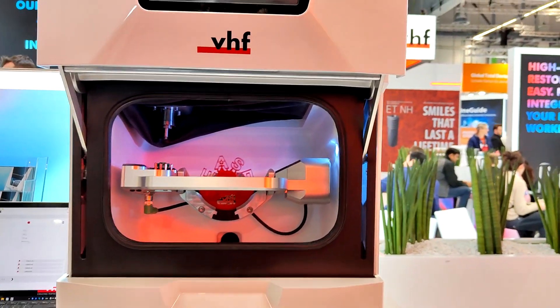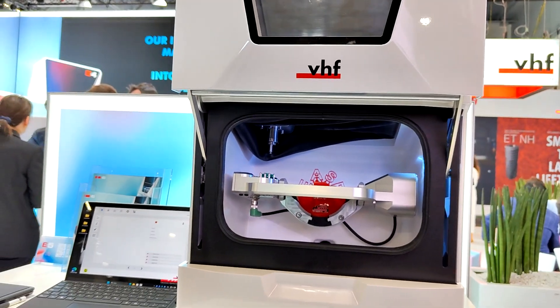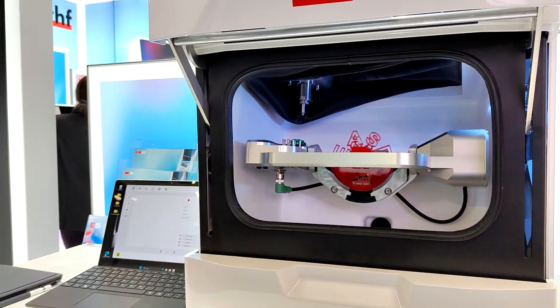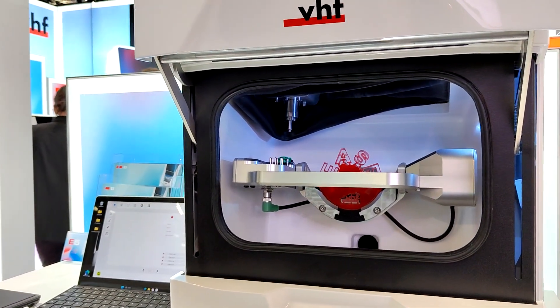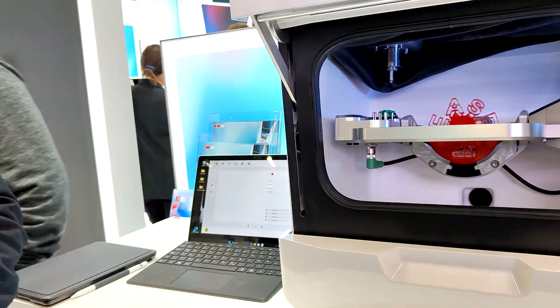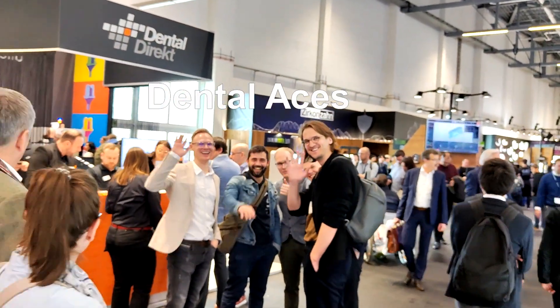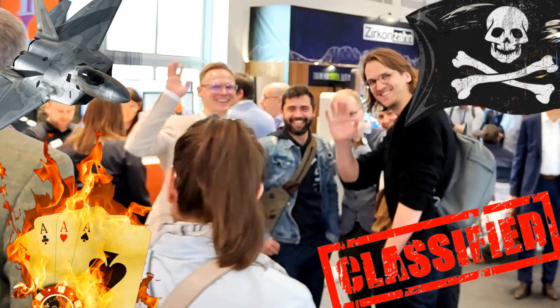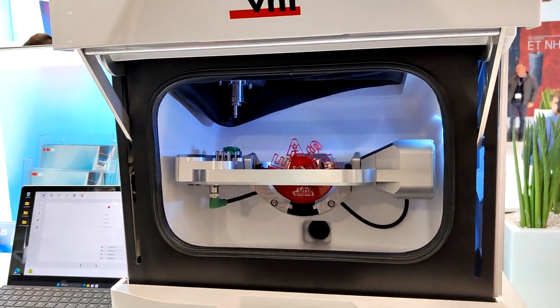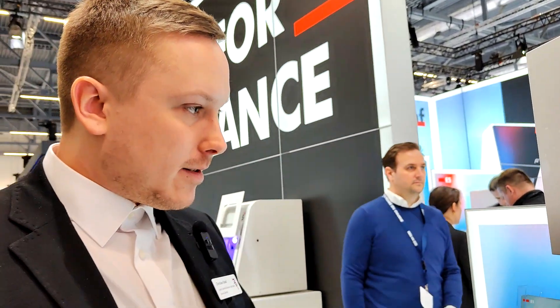The spindle is pre-calculated to run approximately 5,000 to 8,000 hours depending on maintenance. The E5 features an 800-watt spindle — more than enough to mill any material. Metal milling, however, is not recommended or verified by VHF on this machine, but all other materials are fully supported.